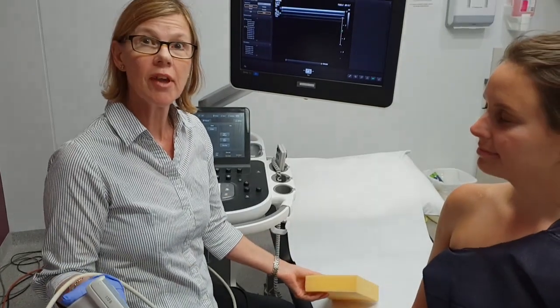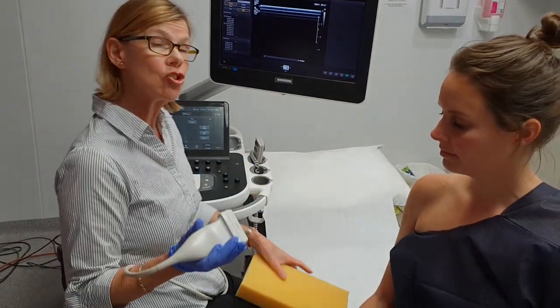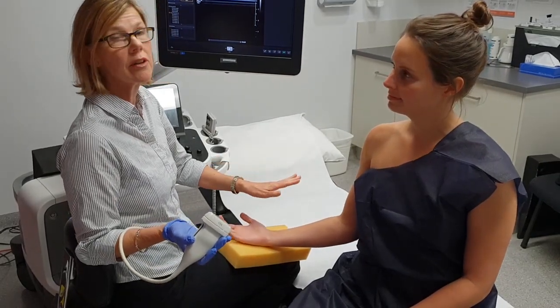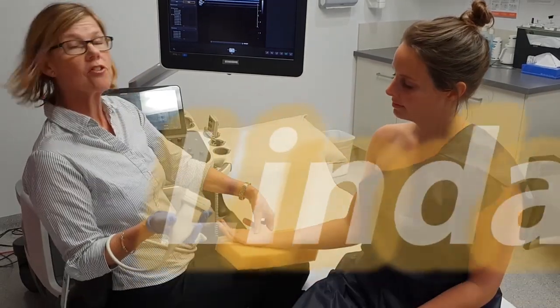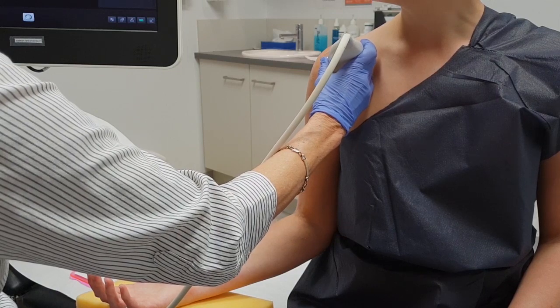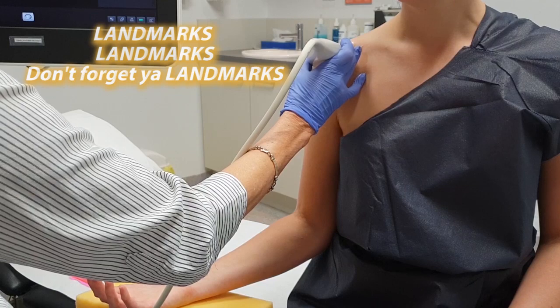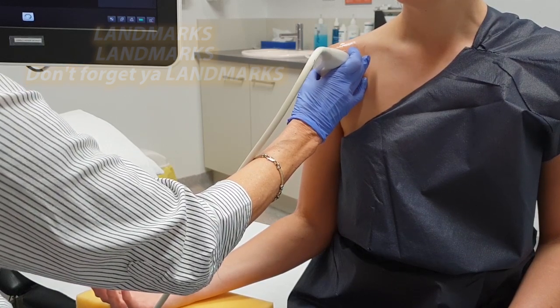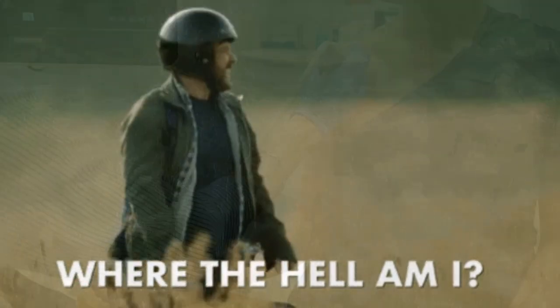When I do the subscap, I sometimes get the patient to rest their arm on a little sponge, because if you've got a sore shoulder it's quite difficult to have your arm suspended in mid-air. This is just a little Linda tip. I always like to have the coracoid at the medial part of the subscap as a landmark. Landmarks are important in ultrasound so that other sonographers and radiologists can review your images and know what position you are actually in, if you've neglected to annotate correctly.